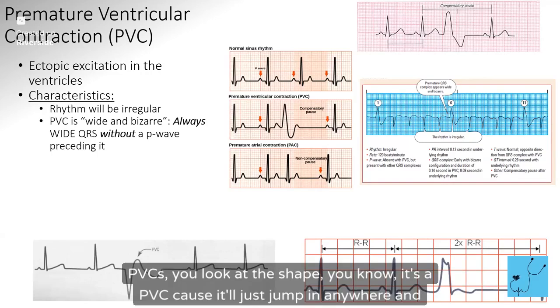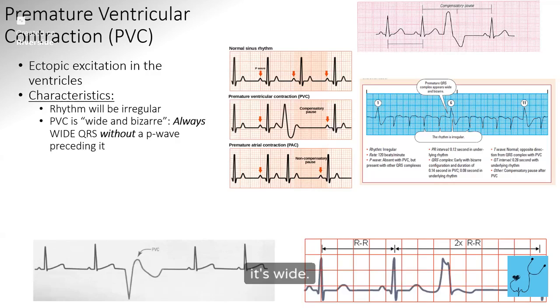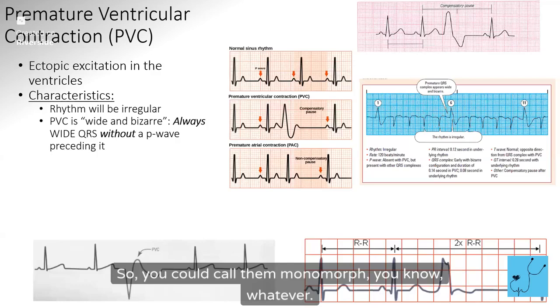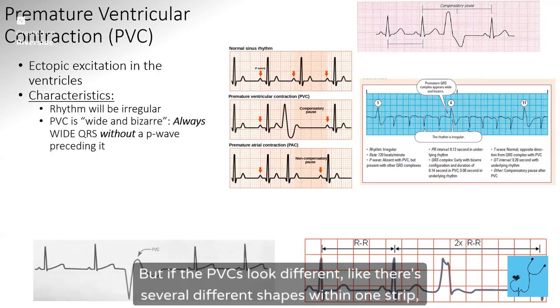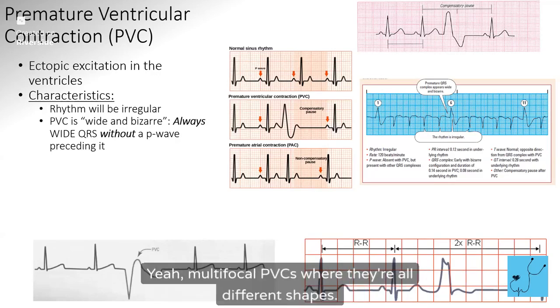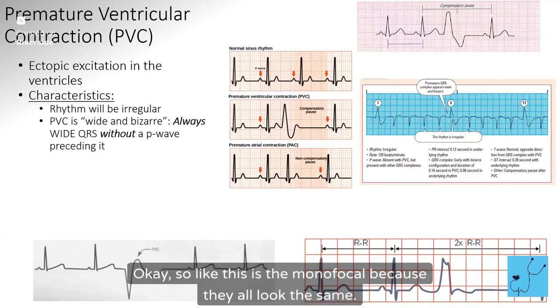PVCs, you look at the shape. You know it's a PVC because it'll just jump in anywhere and it's wide. If they all look the same, they're all coming from the same part of the ventricle, so you could call them monomorphic. But if the PVCs look different, like there are several different shapes within one strip, that means there are several cells in the ventricle causing trouble, and it makes sense that that's worse. Those are multifocal PVCs, where they're all different shapes. Like this one is monofocal because they all look the same.